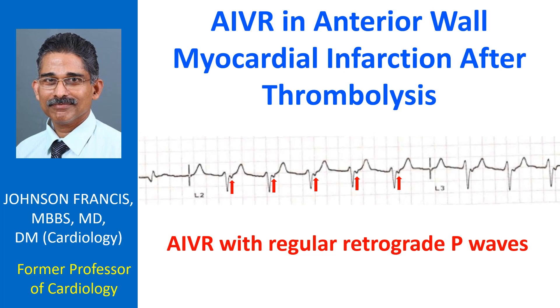Accelerated idioventricular rhythm with regular retrograde P waves. Retrograde P waves are seen just after the QRS in lead 2 and lead 3. The P waves are not that evident in lead 1.